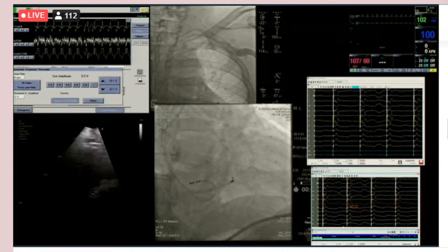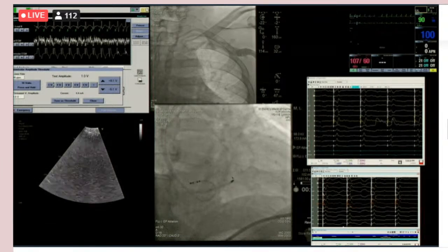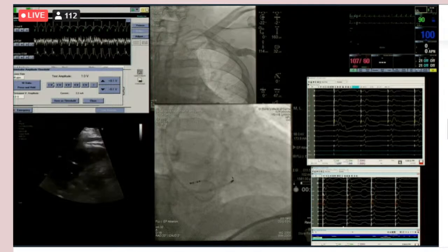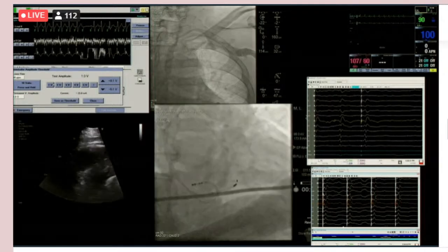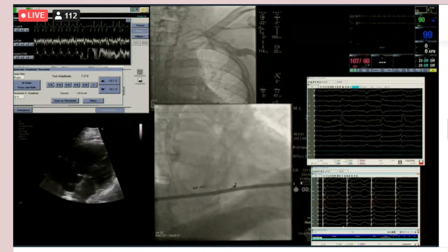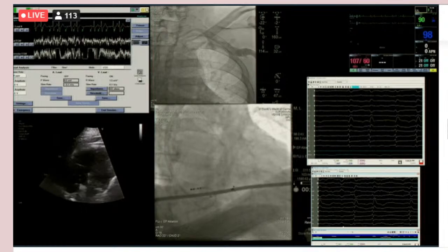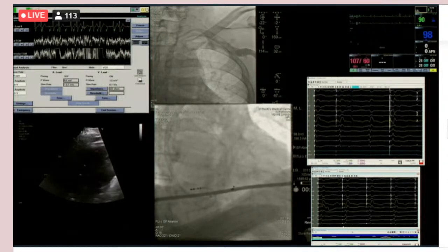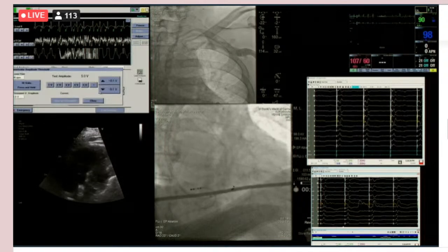Go to 2. 2 volts. Go to 1. 1 volt. Changed again. Okay, see, it's still between 1 and 2 there. Now, it might actually get better, but I'm going to try and just torque it a tiny bit more. Again, it's a little bit like playing chicken. If you go too far, you've got to start over. Back to 5 volts. Go to 2. 531. 2.